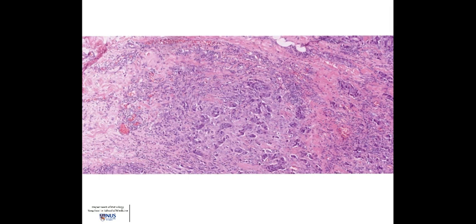At medium power, we can see the architecture more clearly, which is important for grading of the tumour. The tumour appears to be forming tubular structures in a haphazard fashion, surrounded by desmoplastic stroma. This is the classical appearance of a ductal carcinoma. The degree of tubule formation is important in grading of ductal carcinoma.